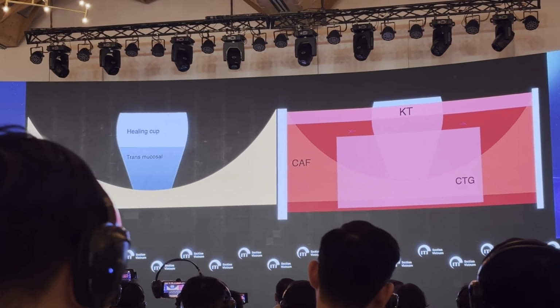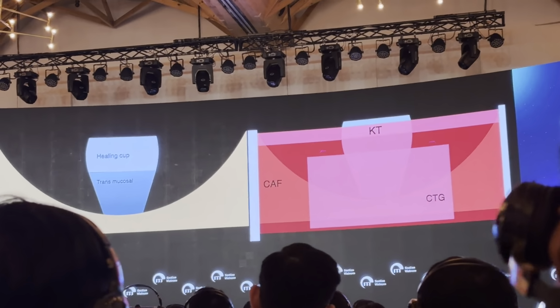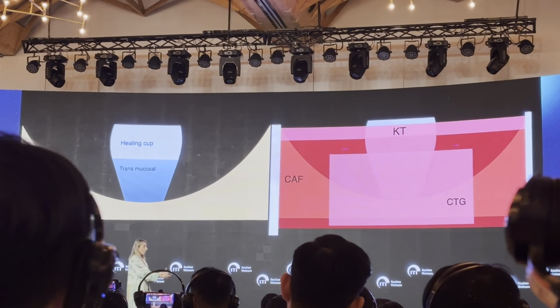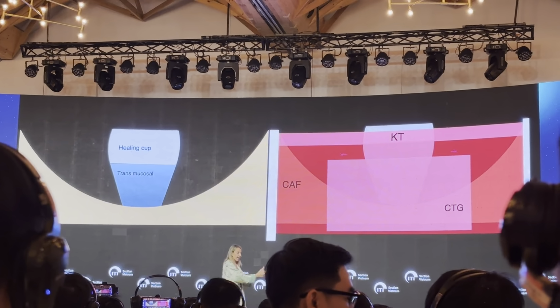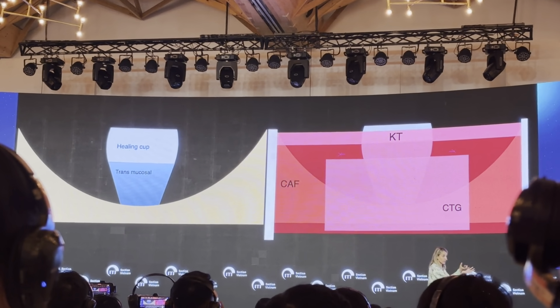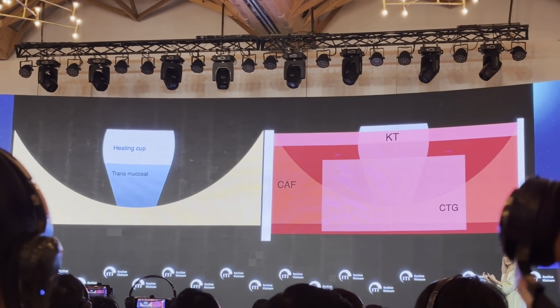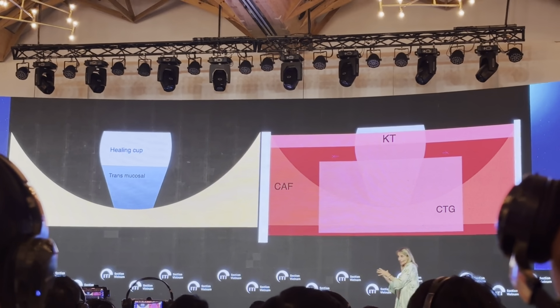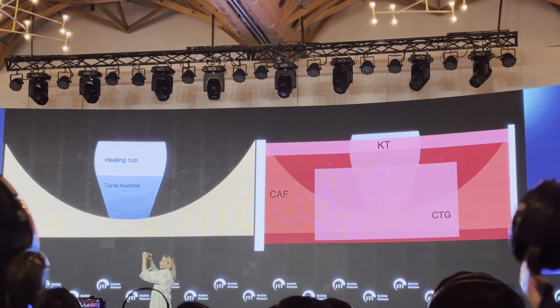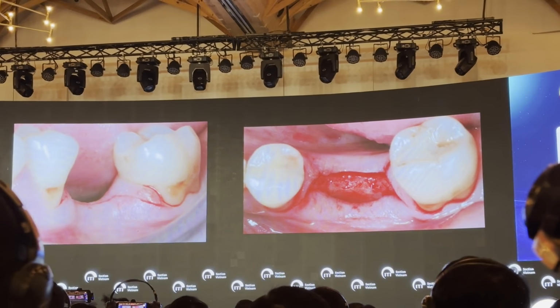That way, I'm compensating for the buccal lingual gap, providing a good emergence profile for the implant supported restoration, and also increasing the supracrestal portion of the soft tissue, because I'm going to coronally advance the flap, placing the connective tissue at the level of the tissue level component of the implant.